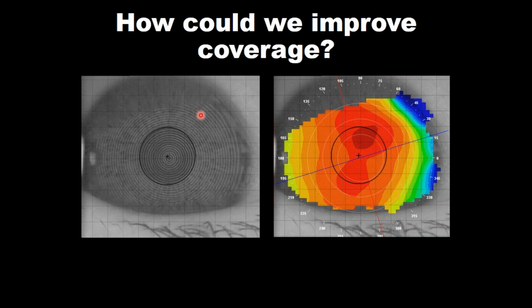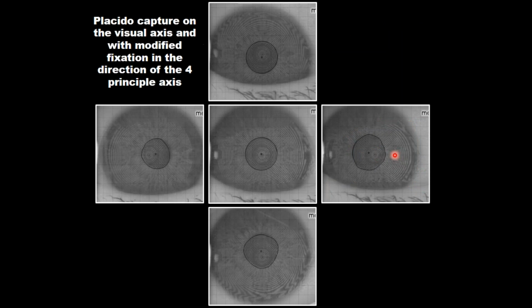So this is a topography where I was able to get the upper lid out of the way, but the eyelash shadows were so significant that it was still blocking so much of the upper cornea. I'm not really understanding the superior corneal shape. And I just couldn't get this lower lid out of the way. The patient was squirmy every time I got near that lower lid or the cheek. So I get a pencil amount of information through the center that isn't really optimal.